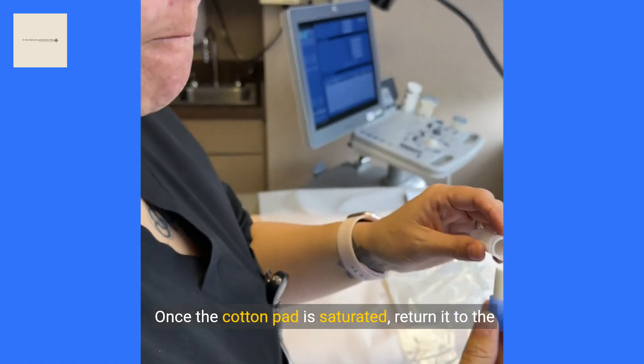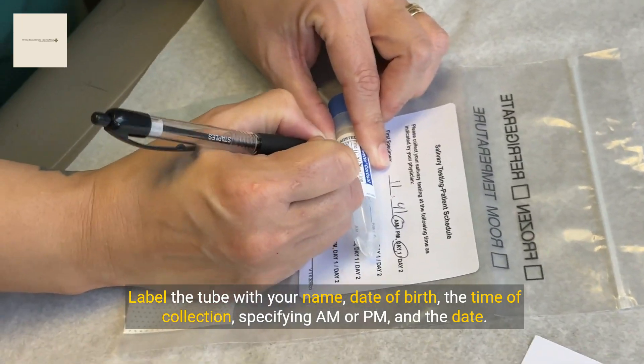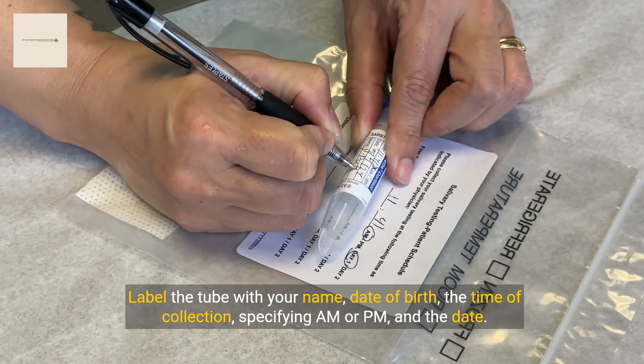Once the cotton pad is saturated, return it to the salivette and close it securely. Label the tube with your name, date of birth, the time of collection specifying AM or PM, and the date.